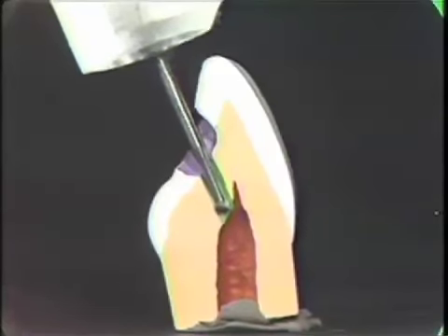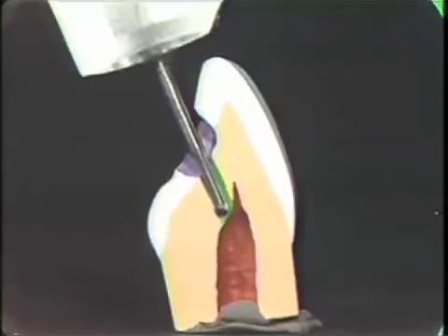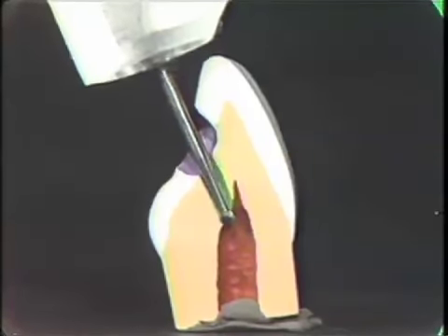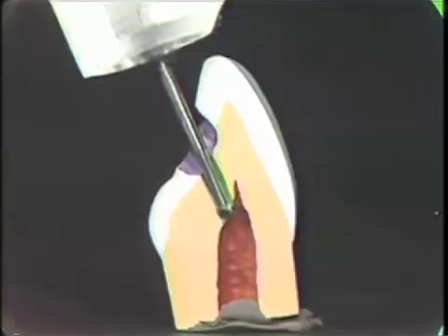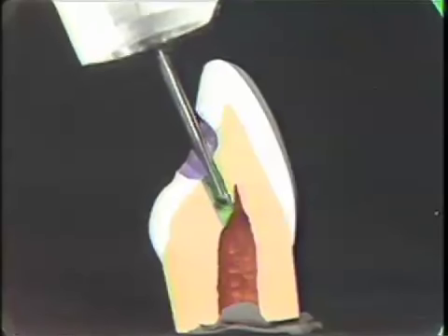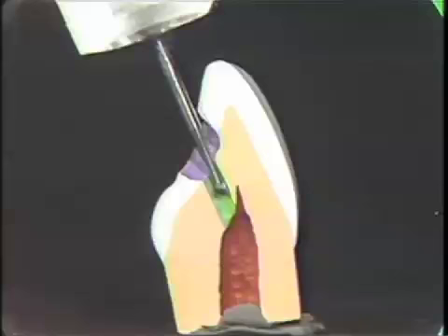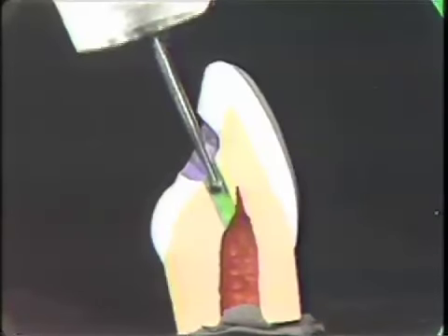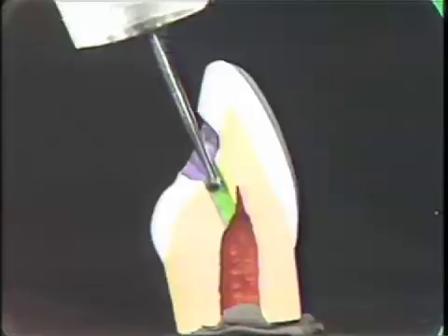You'll know when you get to the pulp chamber when you feel the burr kind of drop into the pulp chamber, as there's a reduction of cutting pressure on the burr. Now, if you have the proper angulation in this step, it's almost impossible to miss the pulp chamber. You have to keep the head of the handpiece tucked over the incisal edge of the tooth.